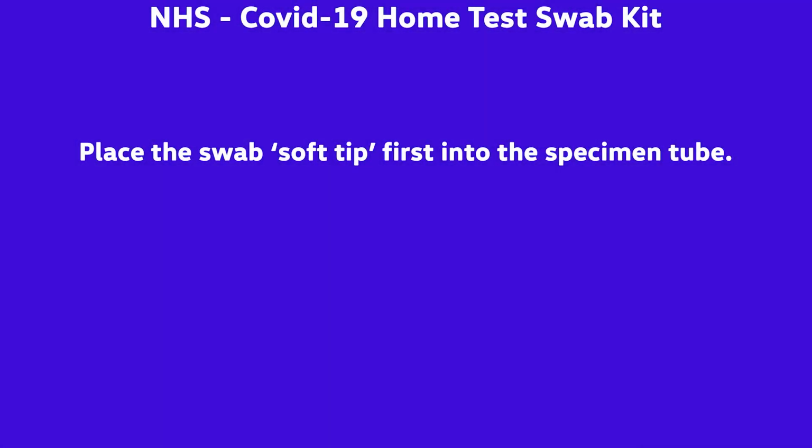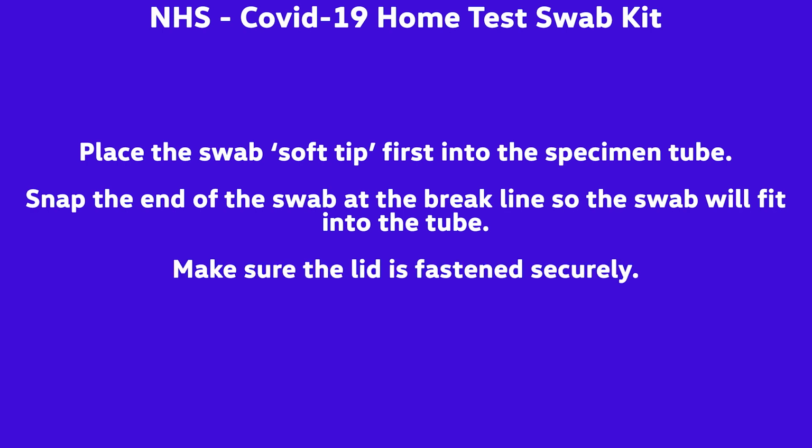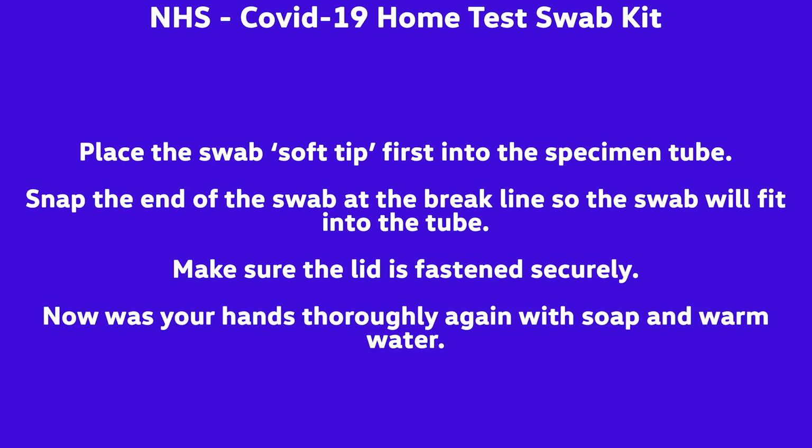Now place the swab soft tip first into the specimen tube. Snap the end of the swab at the break line so the swab fits into the tube. Make sure the lid is fastened securely. Now wash your hands again thoroughly with warm water and soap.